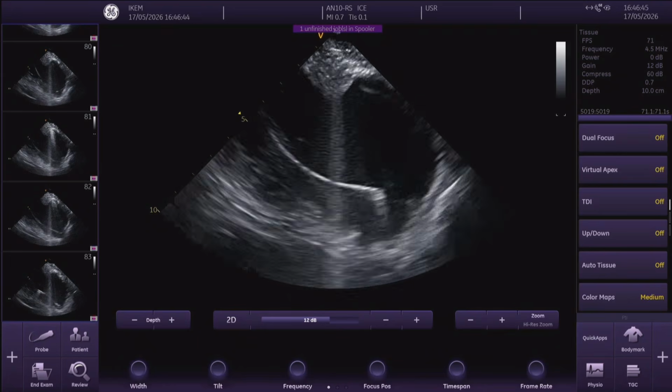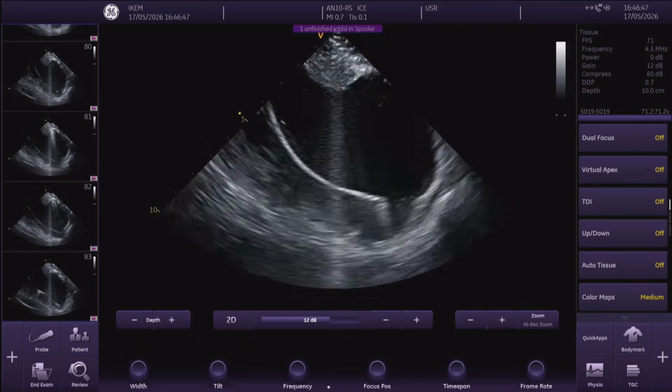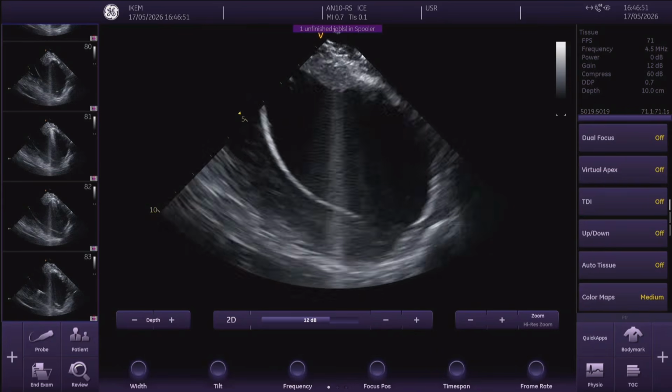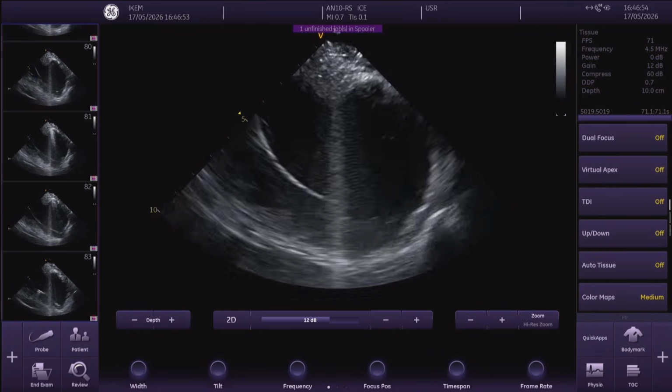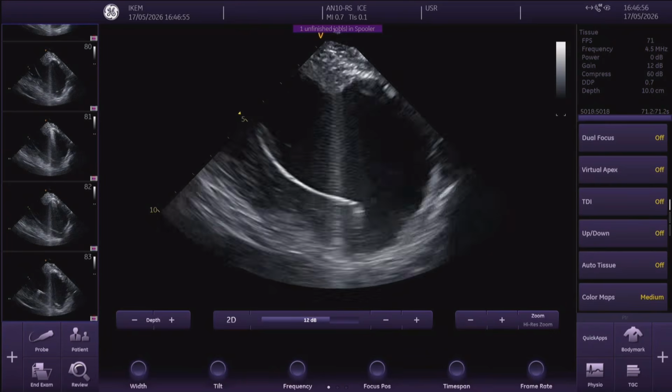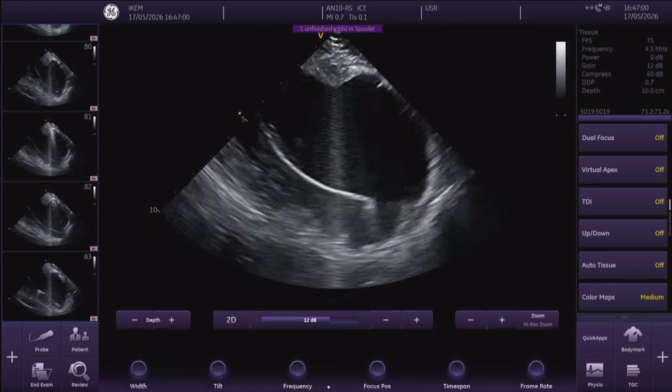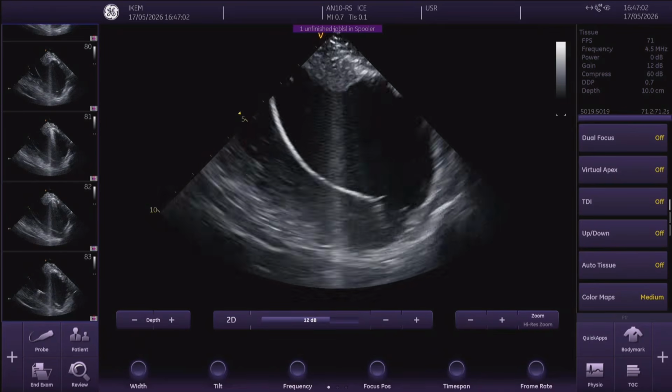But it will take some time, and I think, as you heard, we believe that these are two different things. This aortic area is a substrate, typical substrate for non-ischemic, and the patient has this big aneurysm, which has a lot of slow conduction.